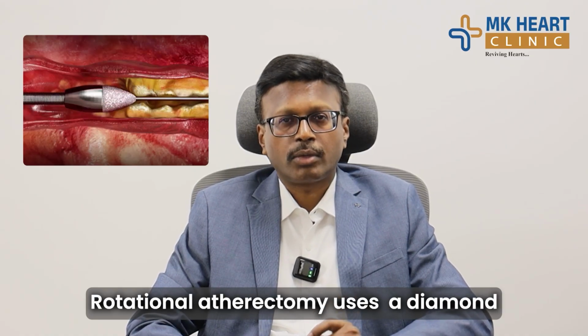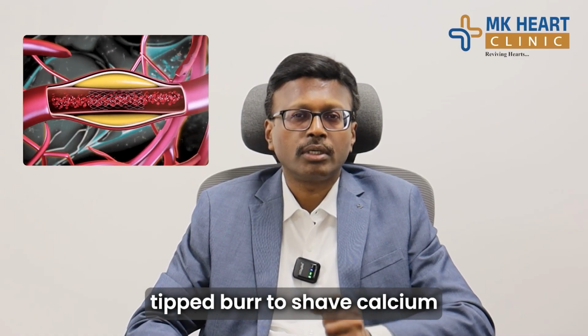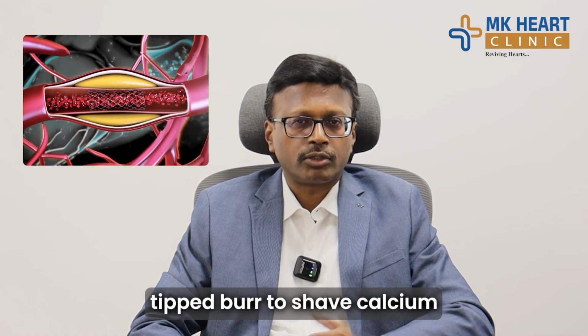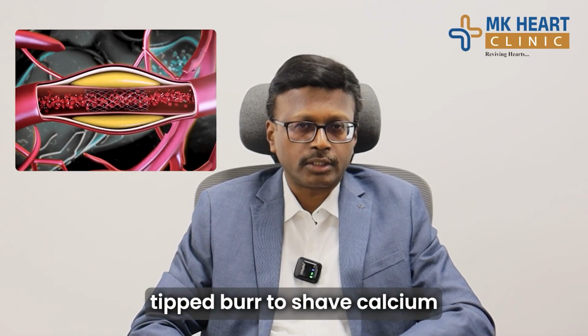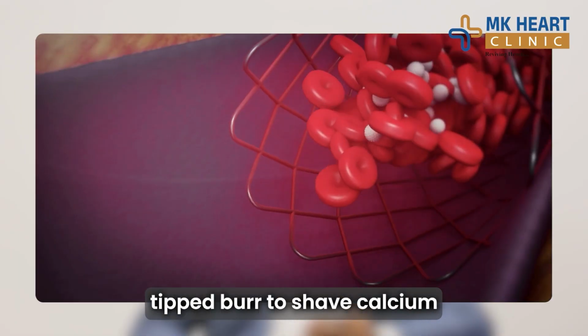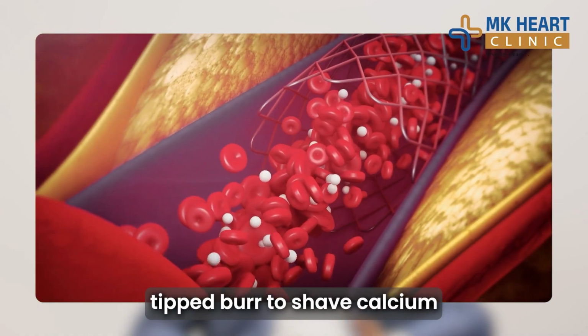It will go inside the blood vessel, rotate 180,000 to 2 lakh times, and the calcium will be cut into smaller pieces. That will be less than 7 to 8 microns, which will be less than the size of the RBCs. So these calcium fragments will be cleared by the reticuloendothelial system. So after the calcium is broken, we can do the routine balloon and implant the stent. So this is called rotational atherectomy.